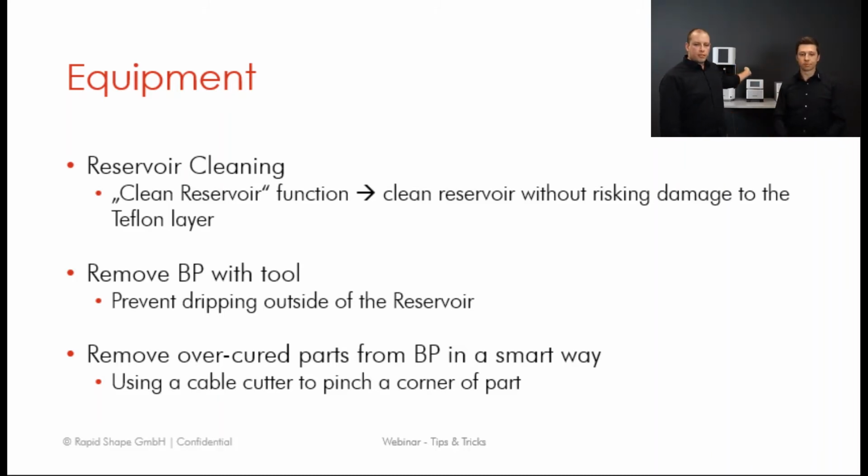The only effect you will have by loosening the build platform holder screws would be to rotate the build platform. So it doesn't have a lift or an angle to it. It's just about rotation so that the build platform is parallel to the print area, so that when you're printing, it comes flush onto the side, or not on the edge of the build platform, but in line with the build platform edge.